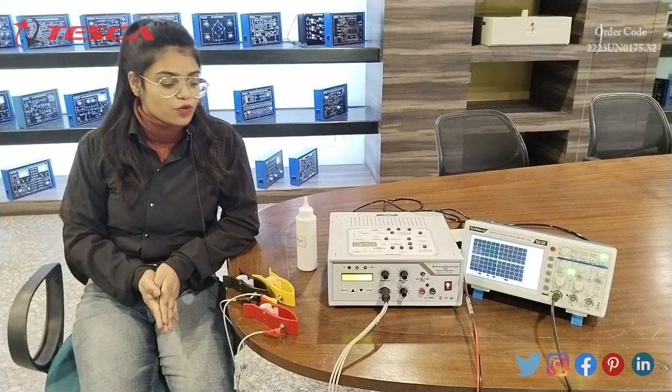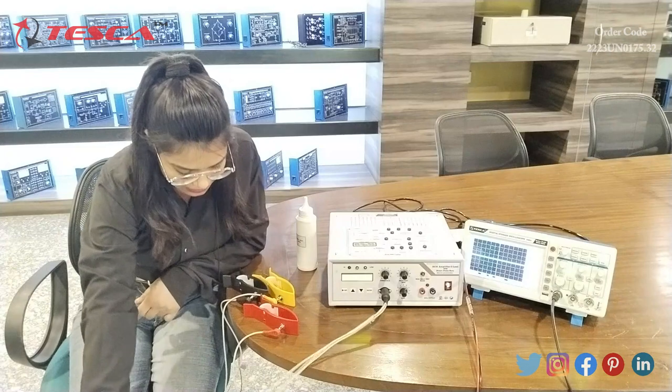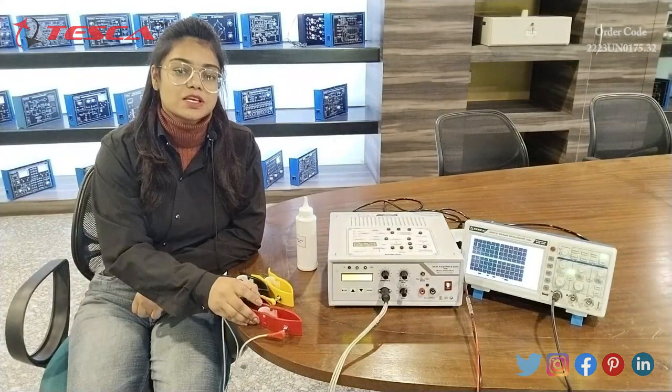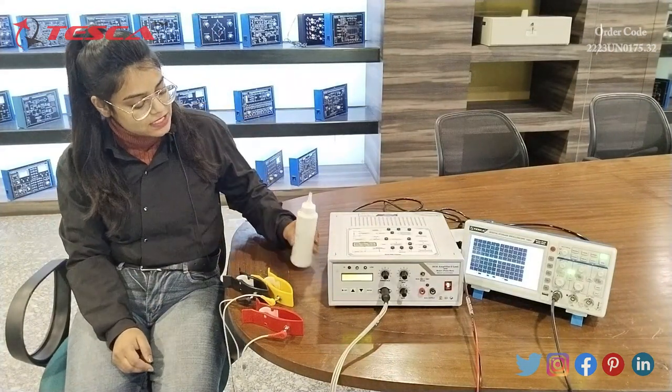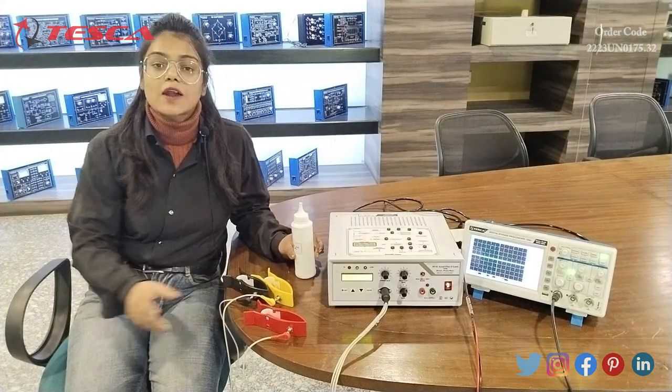Now with the help of this apparatus we will check the BPM of any person. First of all, I have connected this apparatus to the electrodes and I have also connected the electrodes to the clips. Now we will apply ECG jelly to all the clips.